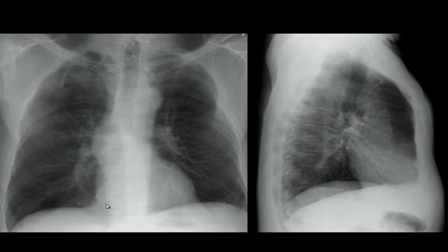Wrong. Subclavian. So you said IJ. Very easy, there's no rocket science here. The initial segment is where it is punctured into the skin. This is a loosely hanging part outside the patient's body. This is the site of puncture. If the original aspect is horizontal, it is subclavian. If the original segment is vertical, it is IJ. This is placed via the right subclavian vein.